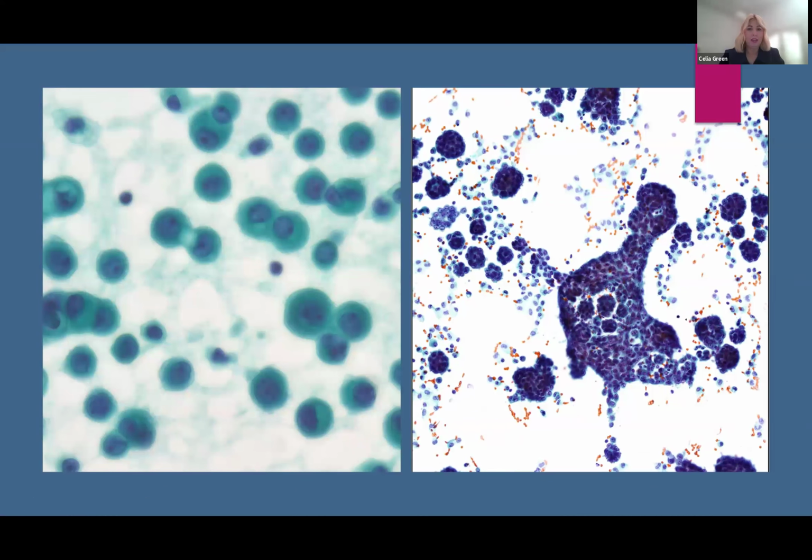And this is the cytological examples. So this is a dispersed mesothelial population. This could be benign or it could be malignant, and there's no way of telling until you get your immunophenotype. But this on the right is one where you can look at it low power and be absolutely certain that this is mesothelioma. So you've got really large aggregates of these cells, which is not a normal situation to happen. So if you get this and we can call you and say this is mesothelioma, great.